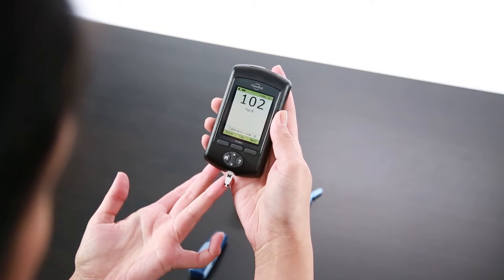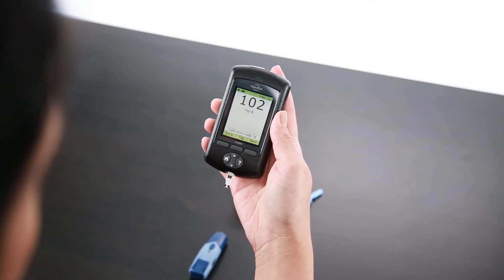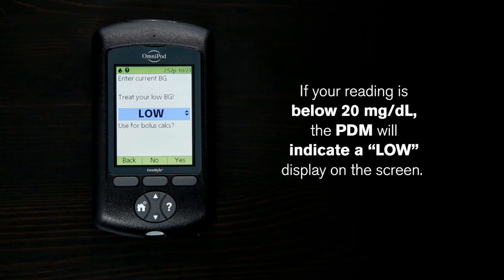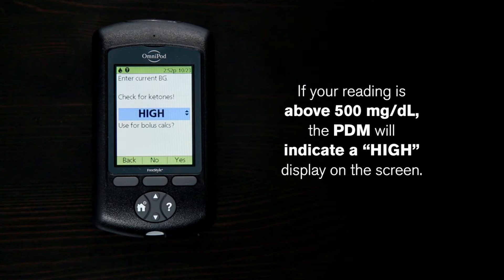If the suggested bolus calculator feature is turned on when you check your blood glucose, the PDM will display the result. If your reading is below 20 milligrams per deciliter, the PDM will indicate a low display on the screen. If your reading is above 500 milligrams per deciliter, the PDM will indicate a high display on the screen.